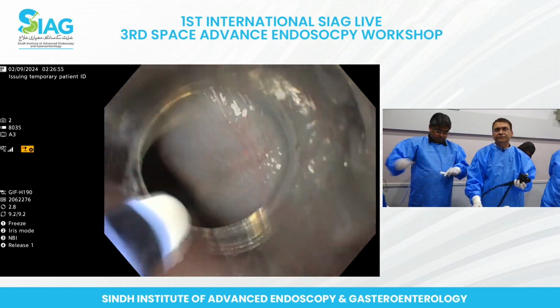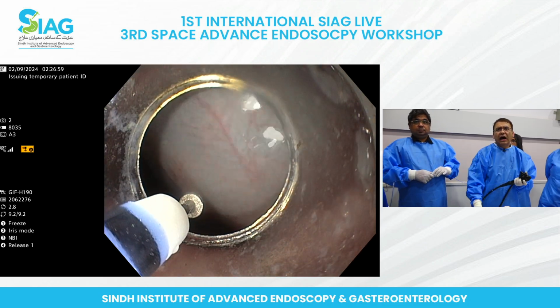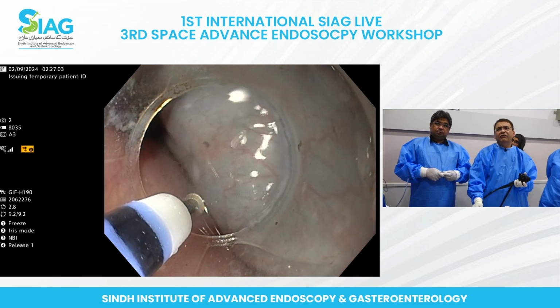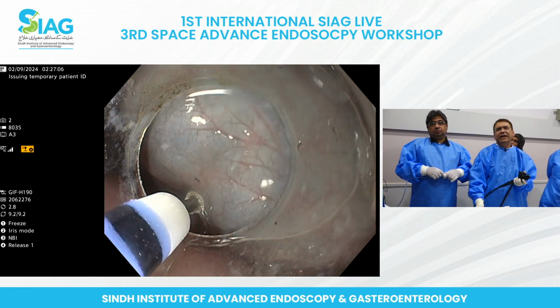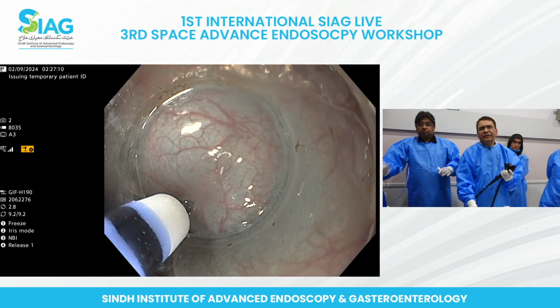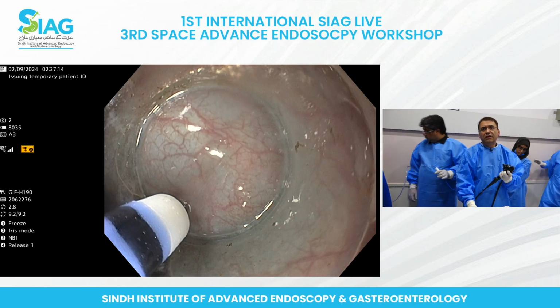Okay, give me the knife. And what I'll do is I will do a vertical incision in this. I will find the area where I started the injection. If visible quickly, then I'll use the same entry point, yellow paddle, just one.